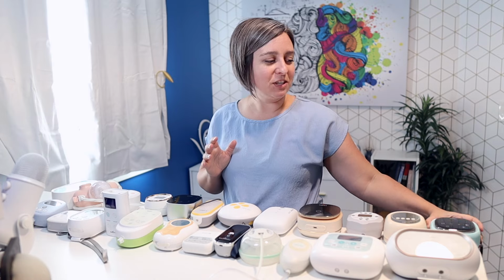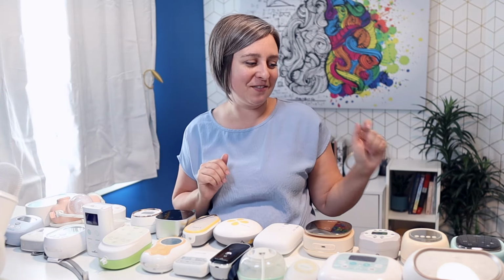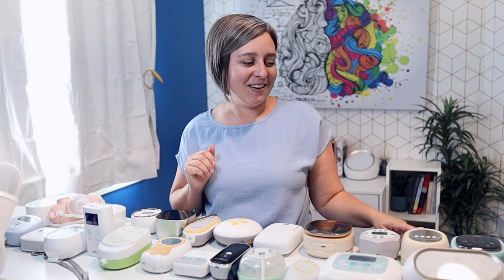Okay, cycle speeds. So we're going to start at the top, which is actually the Zomi 2. I can get it to go 200 cycles per minute, which is really, really fast. Also, that pump has an alternating pattern, so it's going left, right, so it feels even faster. It's very, very fast. And CVI also had quite a high cycle speed. Let me look for you. 197, so that one could go really, really fast. We don't see that very often in portable pumps like this.